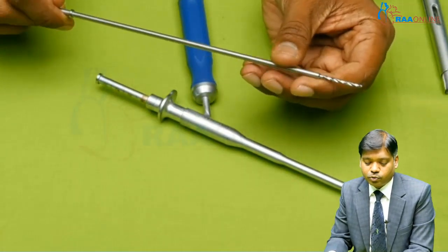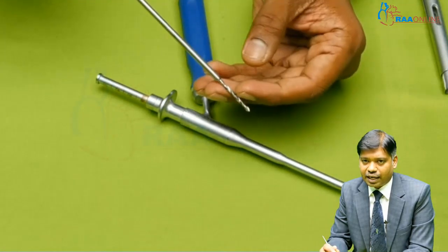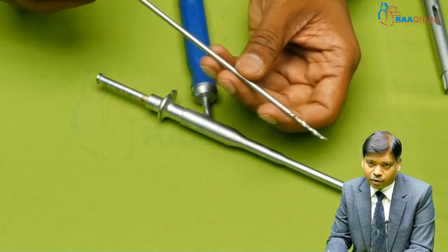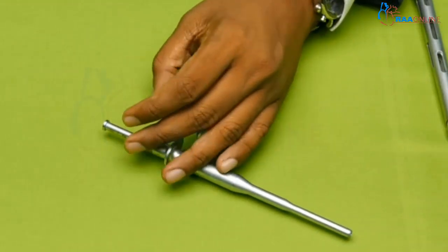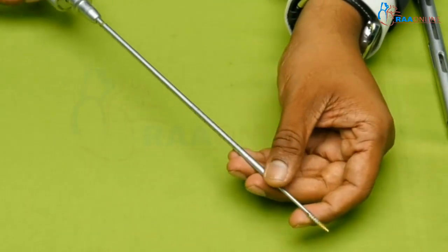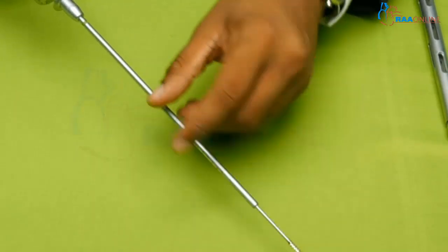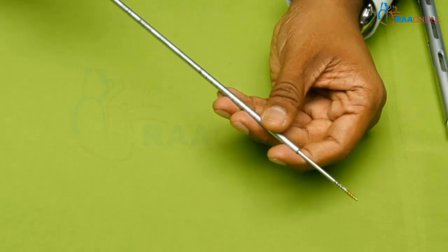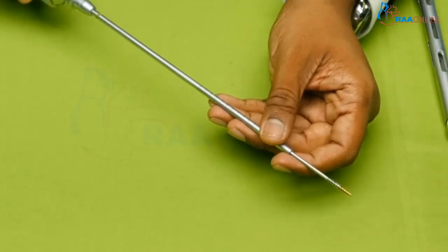That is the purpose of this sleeve and the drill. In the lateral mass we usually do not use probes, because they can damage the lateral mass, which is predominantly made of cancellous bone. So it is better to use a drill. Once you have used a drill, either you can go in with the insertion of the screw directly, or you can use the tap, just like in the thoracolumbar pedicle screw system. This is a 3.5 mm tap which can be used for a 3.5 mm or a 4 mm lateral mass screw in the cervical spine.